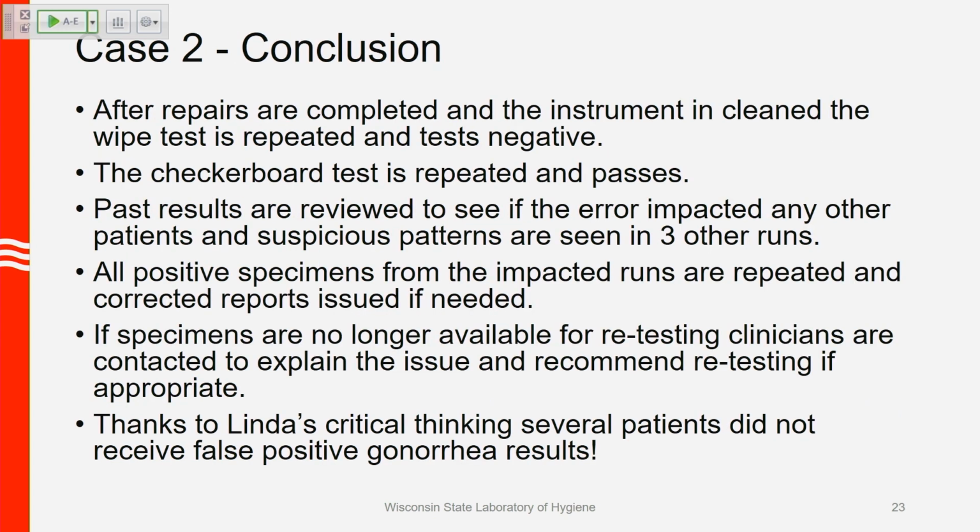So after repairs are completed, the instrument is cleaned and wipe tests are repeated and come back negative. That's good news. The checkerboard is repeated and passes, no signs of carryover and contamination. So they decided to go look at the past results and review them to see if the error impacted any other patients, and suspicious patterns are seen in 3 other runs.